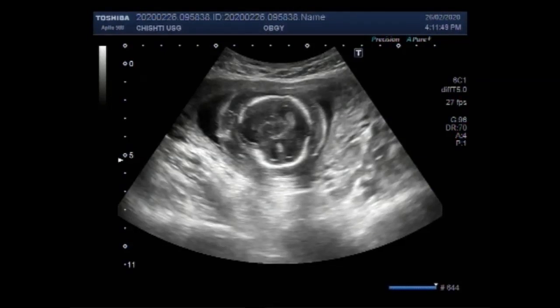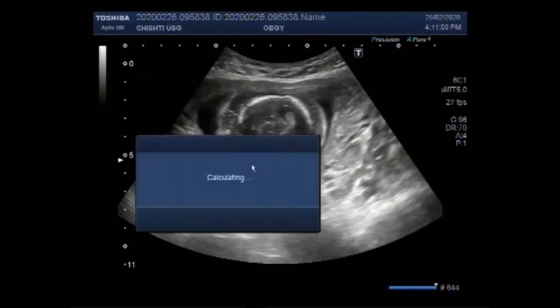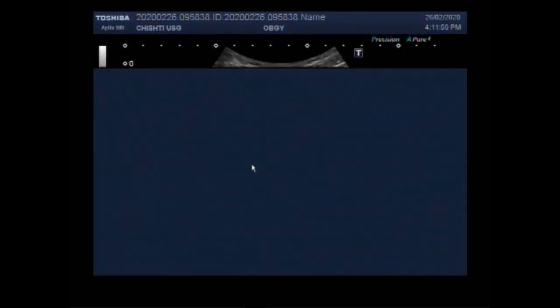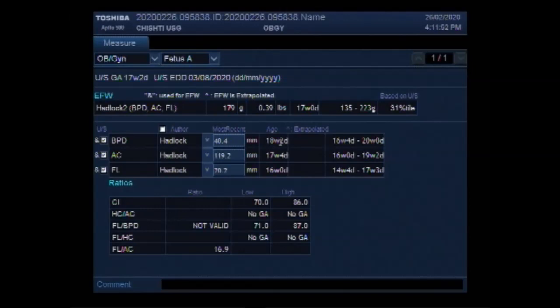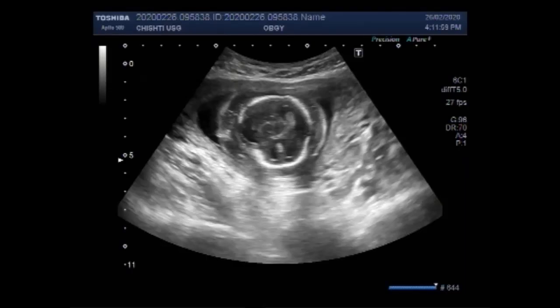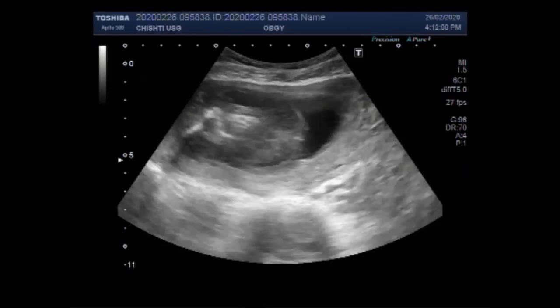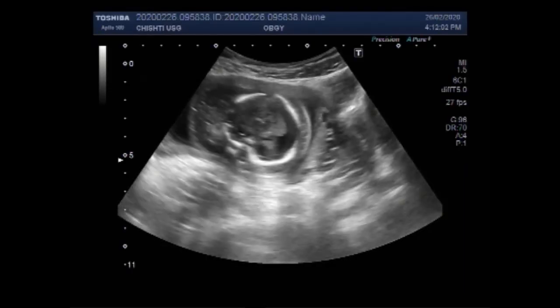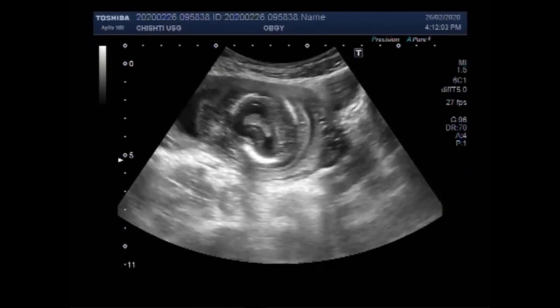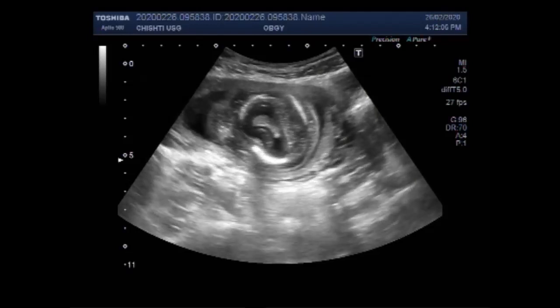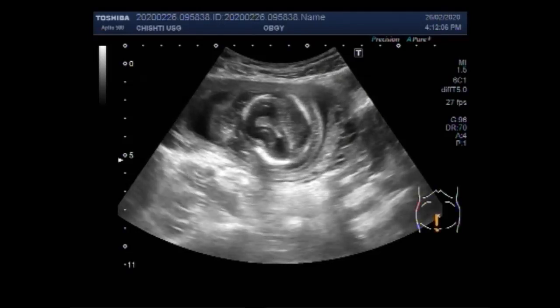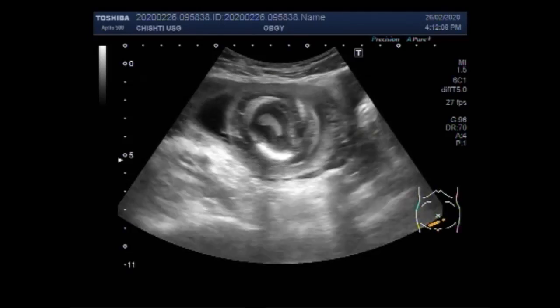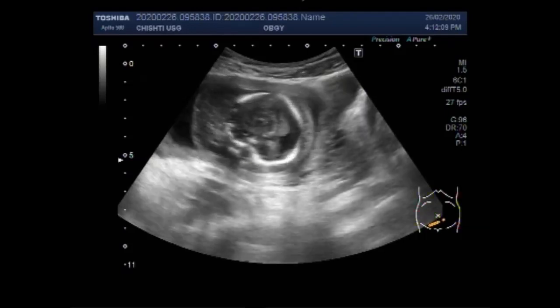This ultrasound video shows multiple fetal anomalies. The pregnancy is about 17 weeks and two days. You can see the fetal head, and significant soft tissue edema is seen around the fetal head.